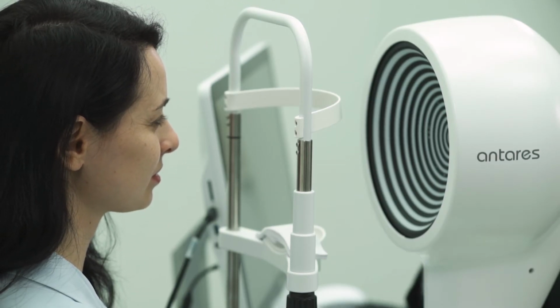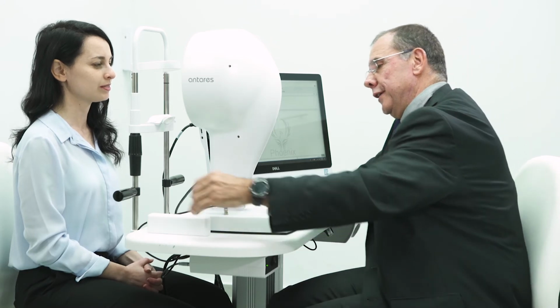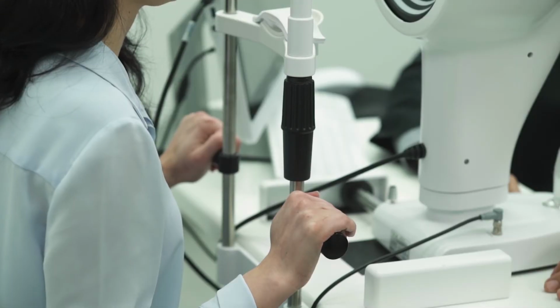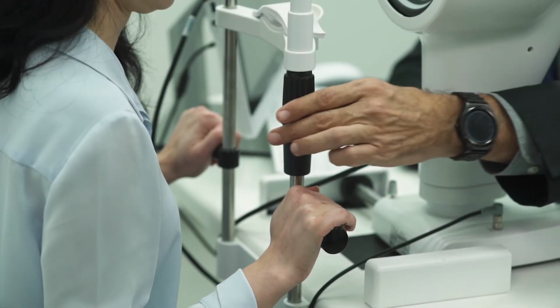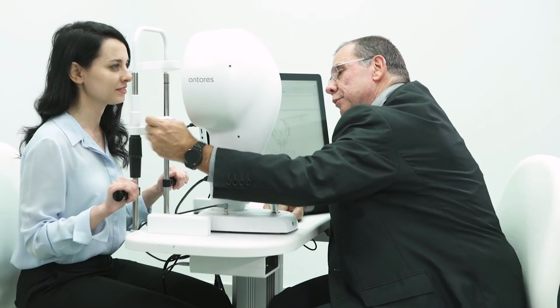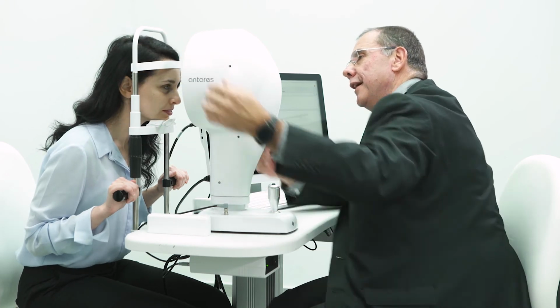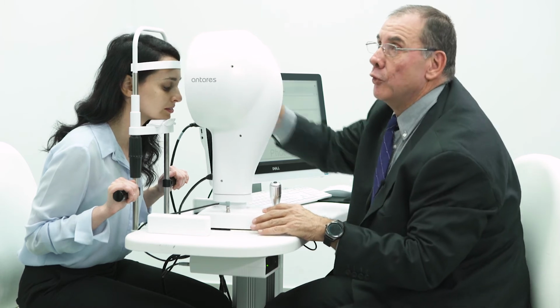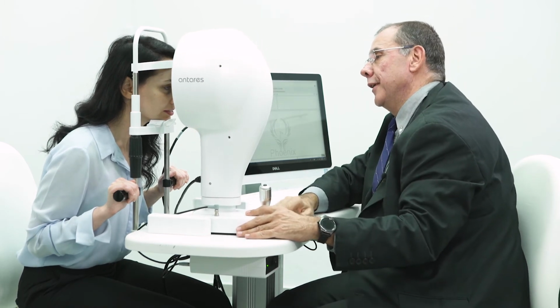Here we have a patient, and what we're going to do is the patient can put their hands on these grips, kind of like the Harley-Davidson grips, and we're going to ask the patient to put the chin inside, and very, very importantly, that the patient presses their forehead against the forehead grip.